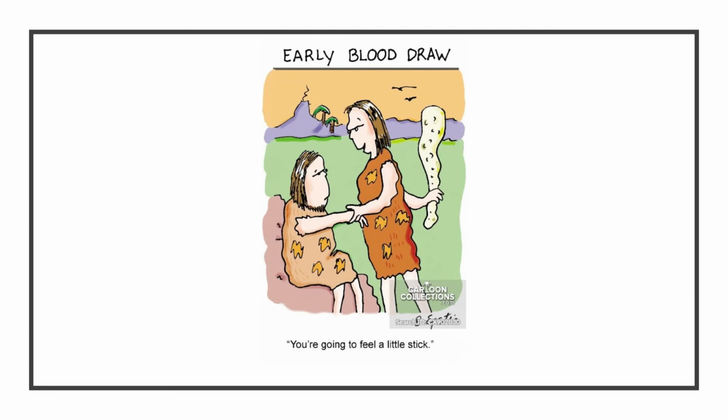After the tracer was administered, we told her to relax in the injection room for 60 minutes. We told her just to stay as still as possible, take a nap if you want. We just didn't want her walking around the room, talking on her phone, anything like that, because that can increase the medication uptake in certain areas of the body where we really don't want it to uptake in.